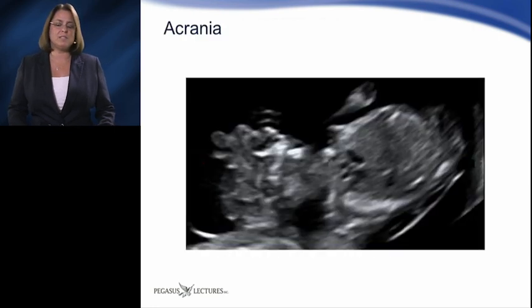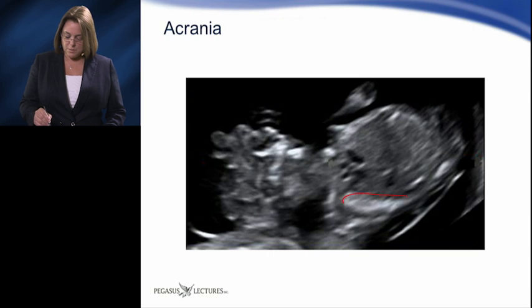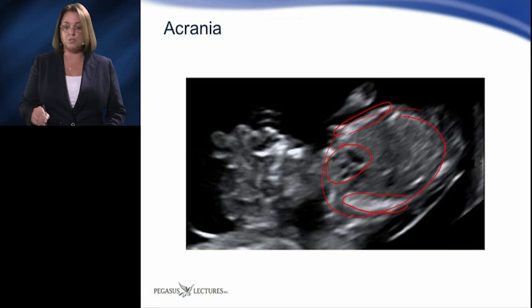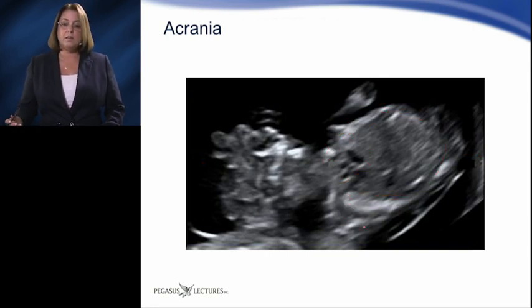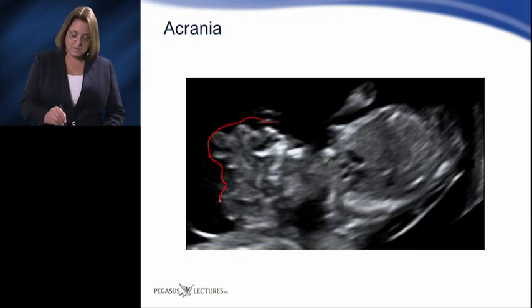This image demonstrates the echogenic ribs, anechoic heart chambers, and the thorax and abdominal tissues. We see the ribs right here, and the heart, and then the thoracic tissues right in through here. The fetal brain tissues are visualized, but the skull is not seen. Here we see the brain tissues.